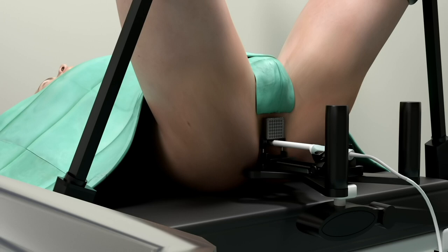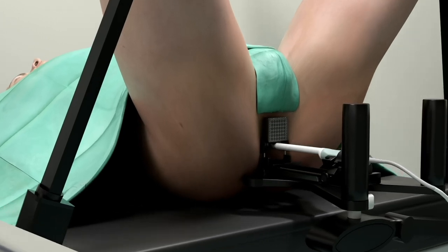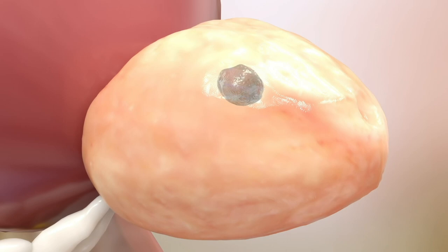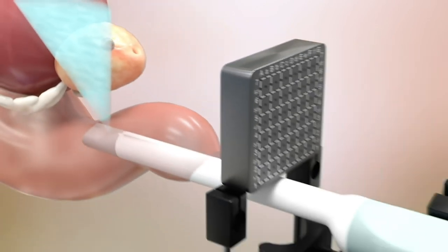The patient is placed in the dorsal lithotomy position at the edge of the table. The ultrasound is then inserted into the rectum, and the prostate is contoured and registered.